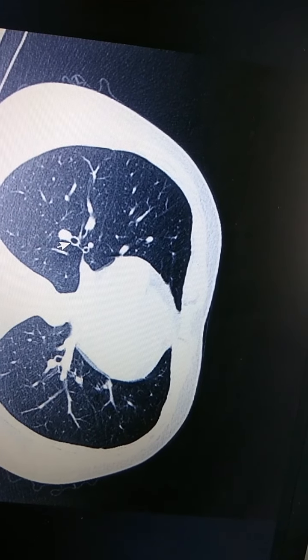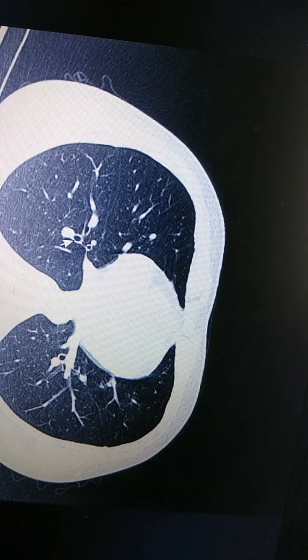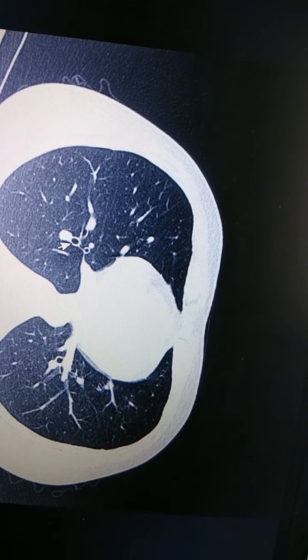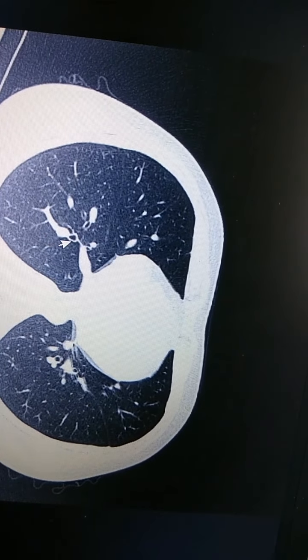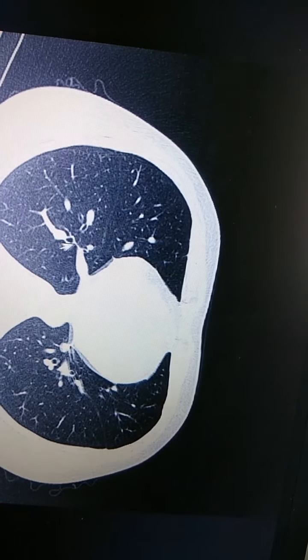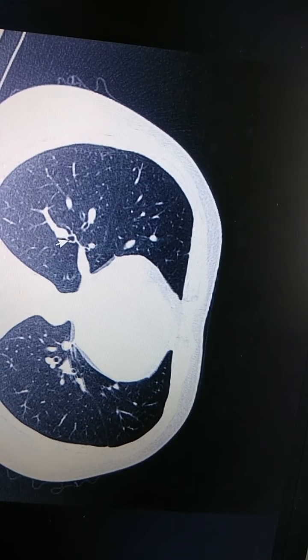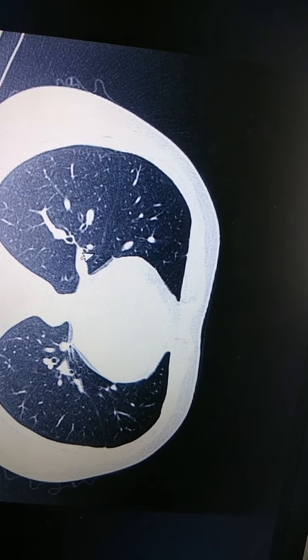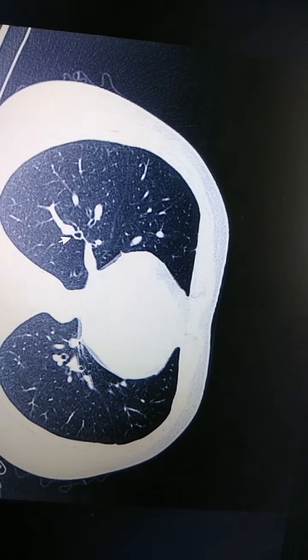This is regarding the right lower lobe bronchus after the superior segmental bronchus is given off. You can see here this is the medial, anterior, lateral, and posterior segments — these are the 4 segmental bronchi. This concludes the discussion regarding the right lung.